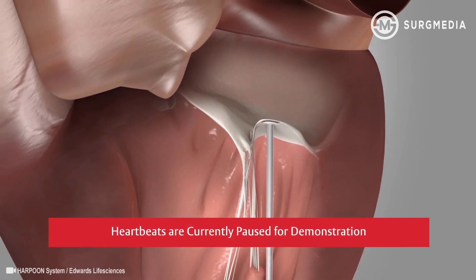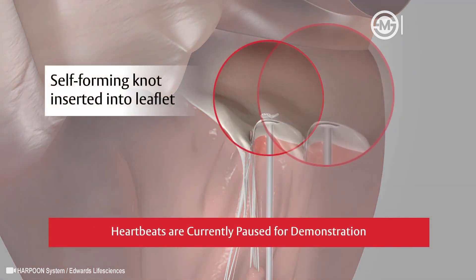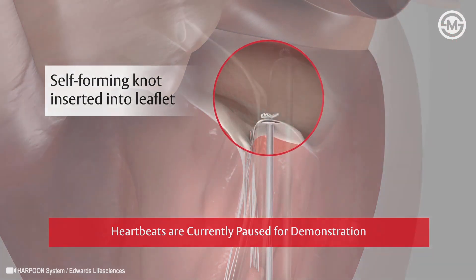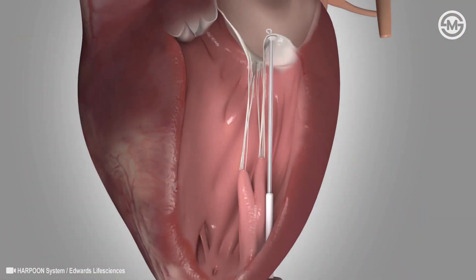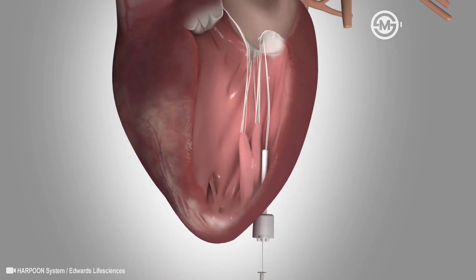When the position is confirmed, the delivery system is activated by pushing the plunger on the device. A needle with a self-forming knot is inserted into the leaflet and withdrawn. Once the knot is anchored, the device is removed, leaving only a string or cord attached to the leaflet.